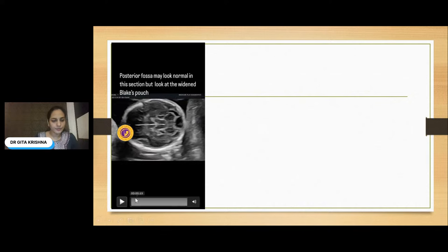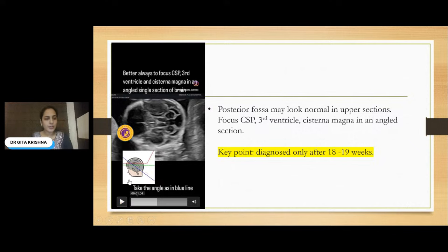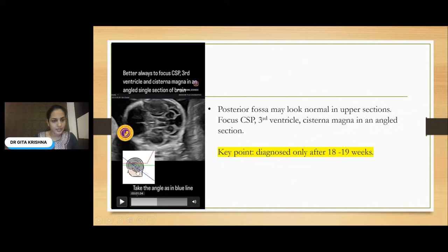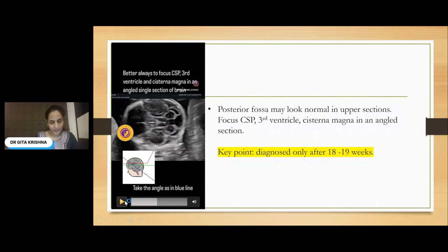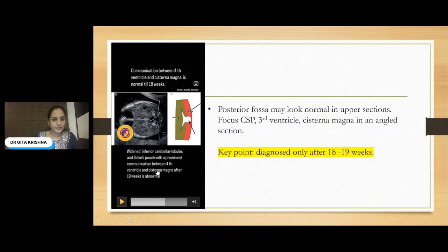Here is the video. Make sure that you screen the head in an angled position, shown by the blue line here, so that the cavum septum pellucidum, third ventricle, fourth ventricle, and cisterna magna are all covered. That way this view will come and help us in diagnosing isolated inferior vermian hypoplasia. The posterior fossa will look normal, but it is not in this variant type of Dandy Walker. This finding is absolutely normal before 18 weeks, so we shouldn't get confused for inferior vermian hypoplasia before 18 weeks.